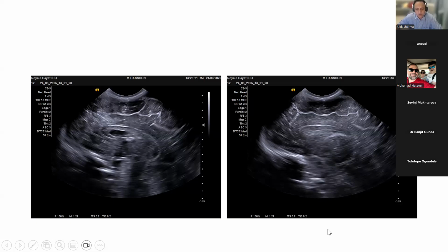It's a little bit of dropout, and nothing that would worry me if the baby is completely normal and you have no history. That would suggest the baby's had hypoxia ischemia. So a very nice image again. This is your right side. And this is going to be tricky because this baby has very small ventricles.